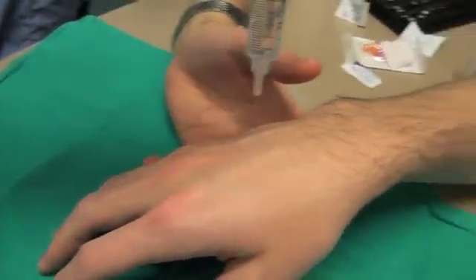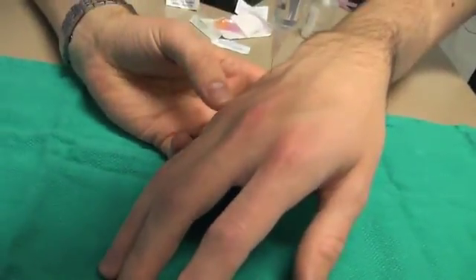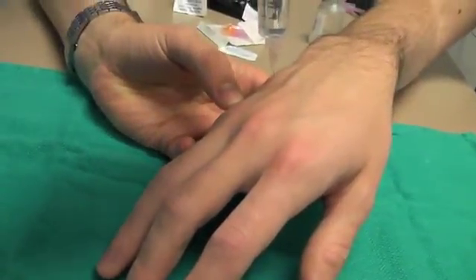On the radial side, and now passing on the ulnar side of the bone.